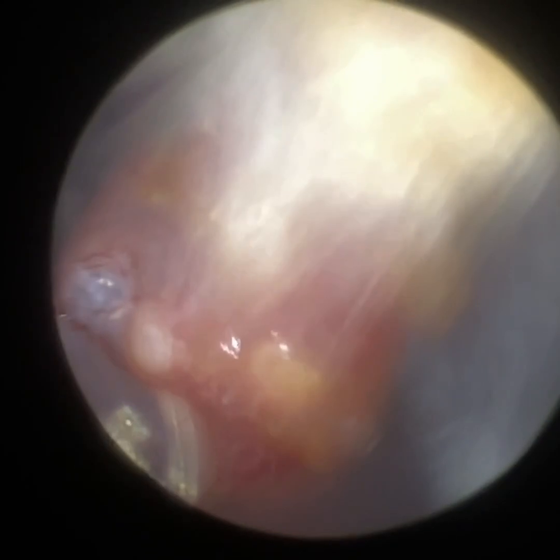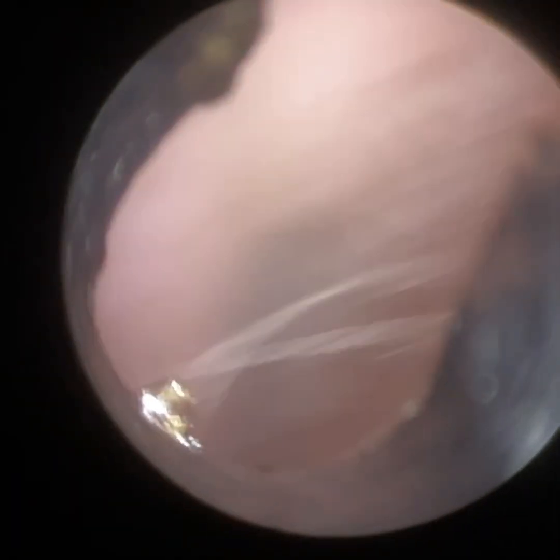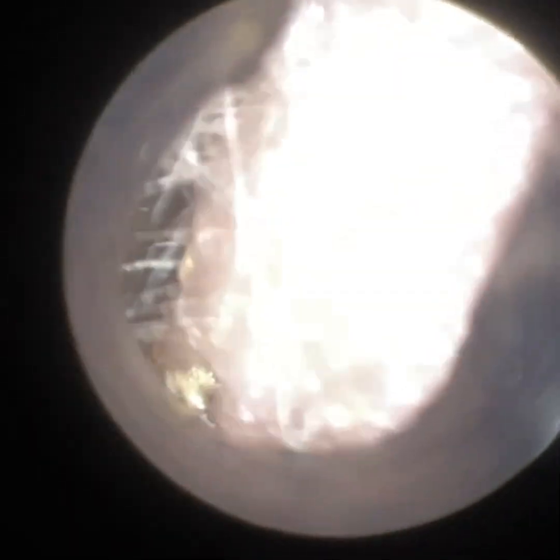You can see the capillaries and blood vessels there. The hair is slightly there but we can still mitigate that. That last view gives you an idea of how narrow the ear was.